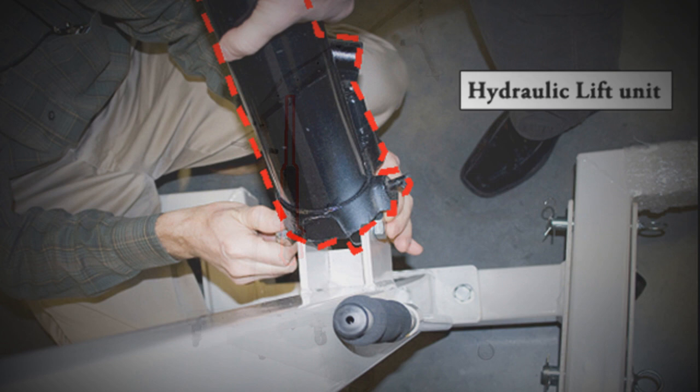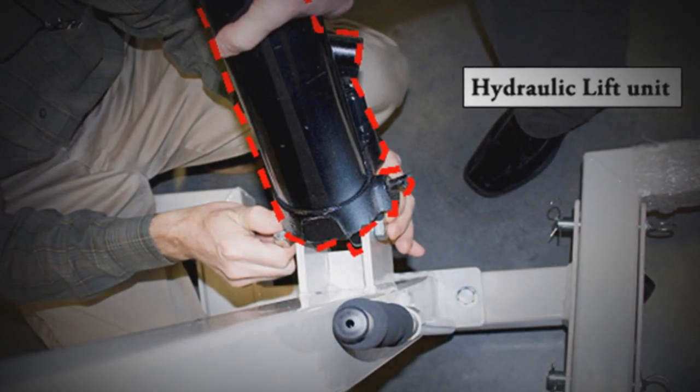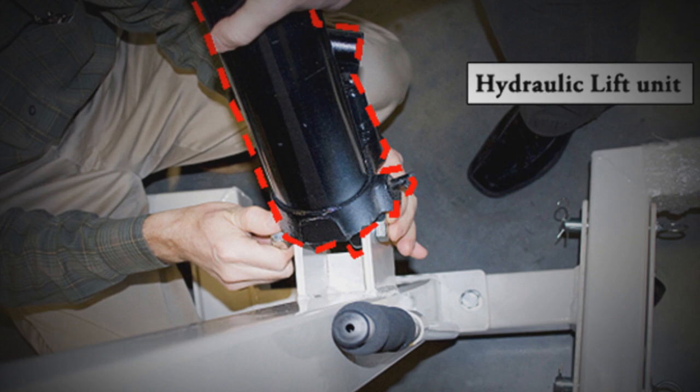Now, you can attach the bottom of the hydraulic lift unit to the center support beam bracket. This also requires at least two people, as the hydraulic lift unit is heavy and must be held in place while tightening the bolt.